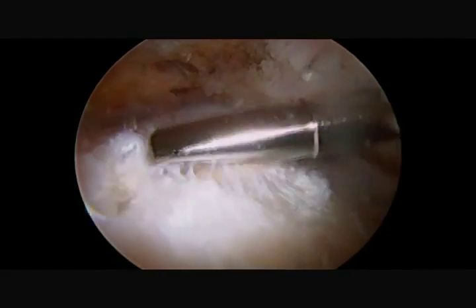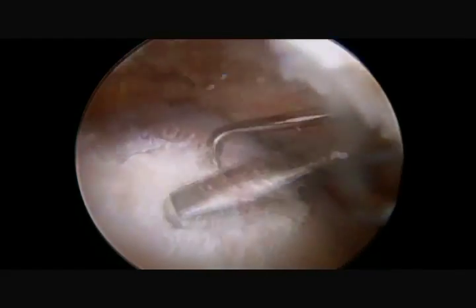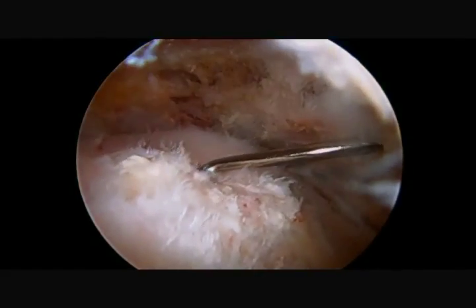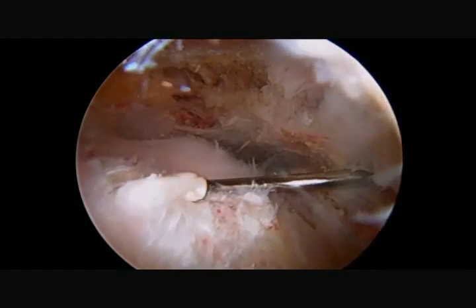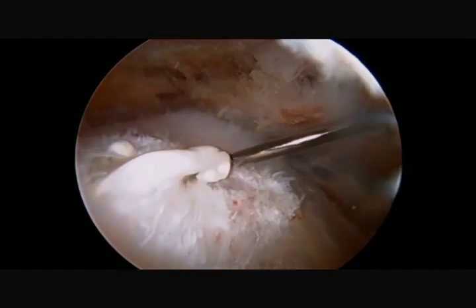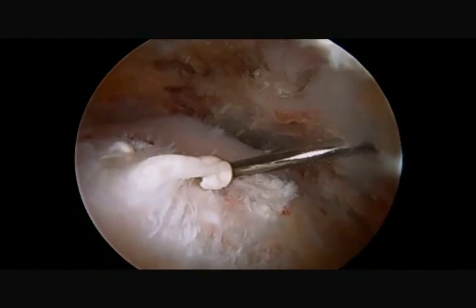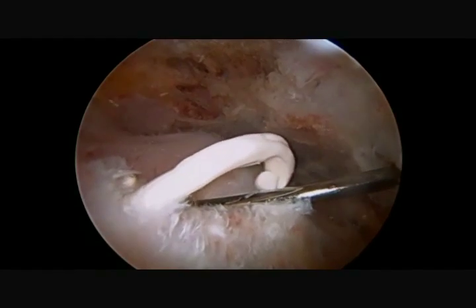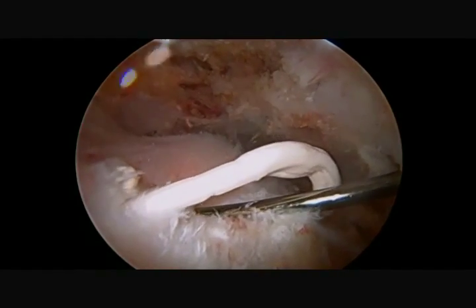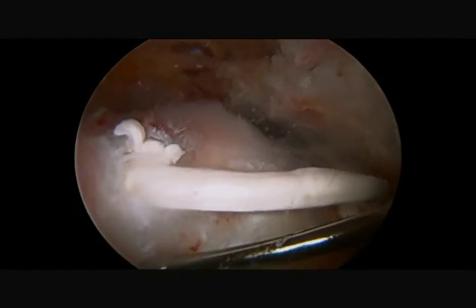The shaver is then used to unroof and debride the area. There still appears to be a fairly large amount of calcium remaining on the tendon, and a probe is used to express this calcific deposit. The remaining portion of the calcific debris is removed, along with a small superficial layer of the rotator cuff.